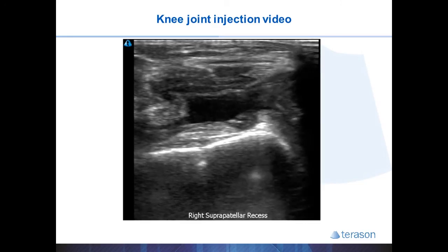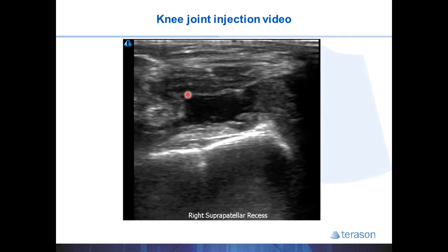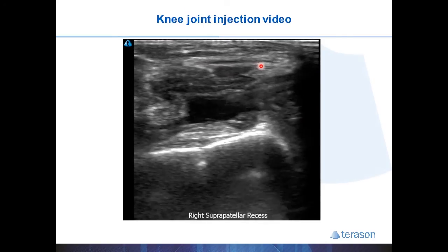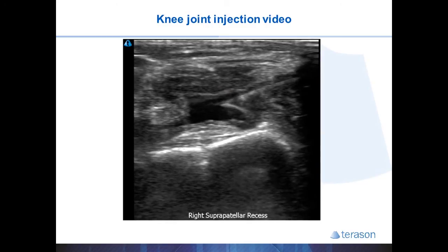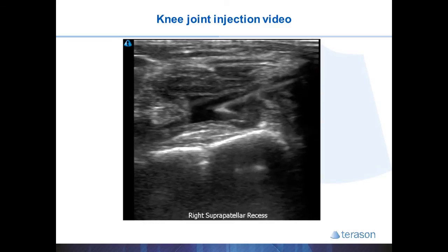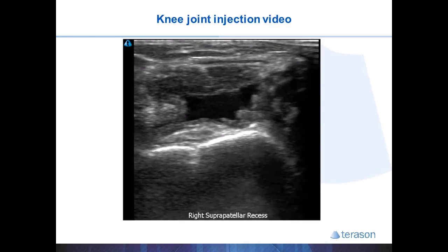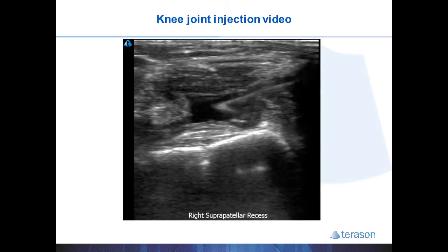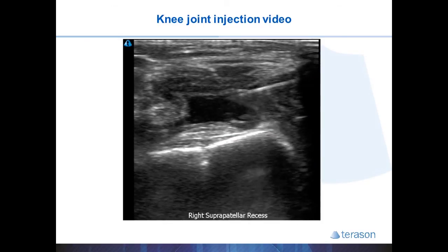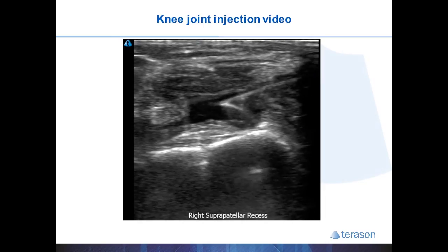Here is an example of a knee joint injection where you can easily see the quadriceps tendon in transverse view. Beneath it you find the anechoic joint effusion, just below that the pre-femoral fat pad, and the hyperechoic line of the femur. The needle is coming in from right to left, quickly injecting the cortisone, and is then retracted.